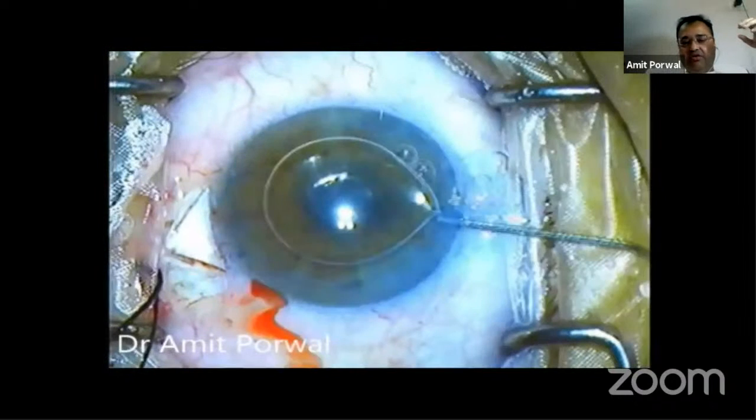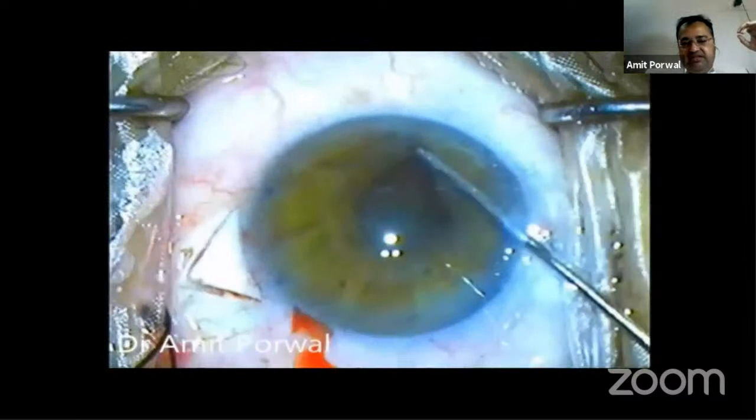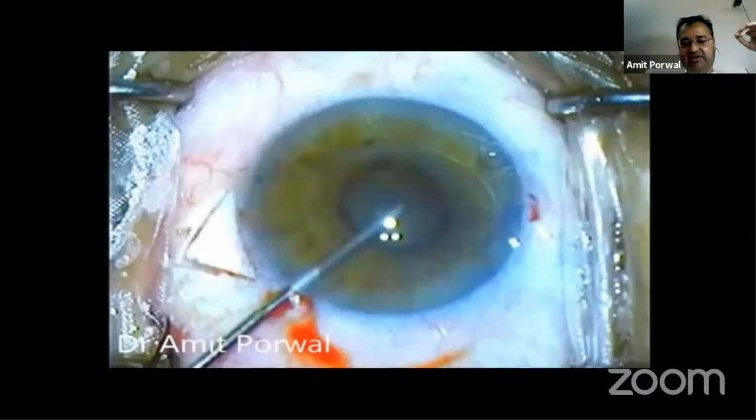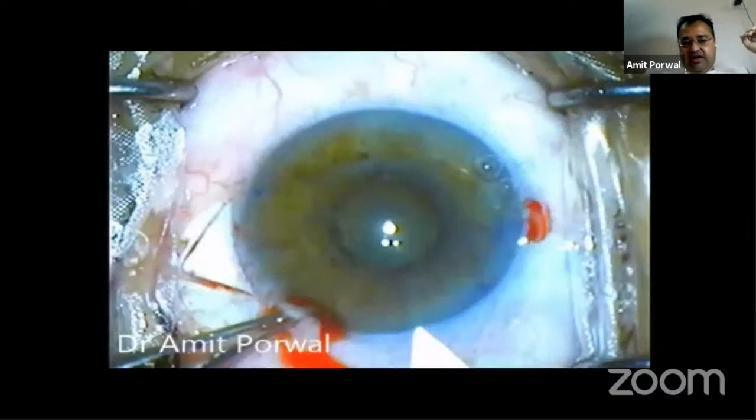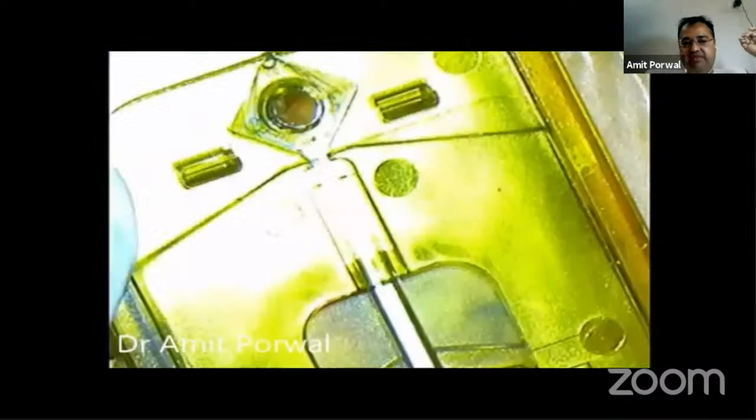It is a case of complicated cataract, post uveitic. There is a small pupil. I have done a synechiolysis after injecting dye under the air bubble and after injecting sodium hyaluronate. After doing synechiolysis, the pupil was still not dilated much. So after making the main corneal incision, I plan to use the Malyugin ring.